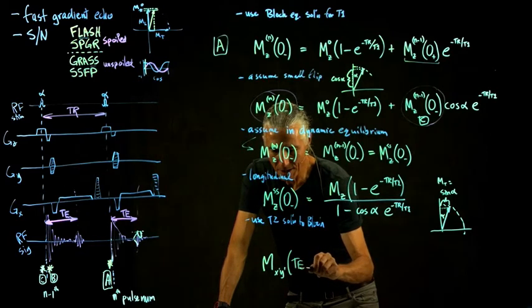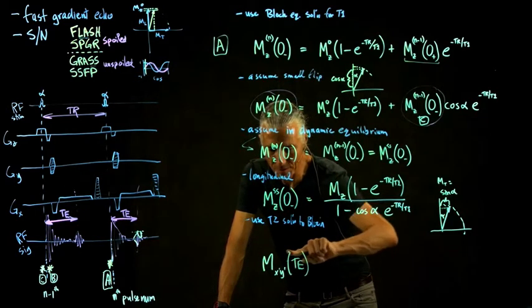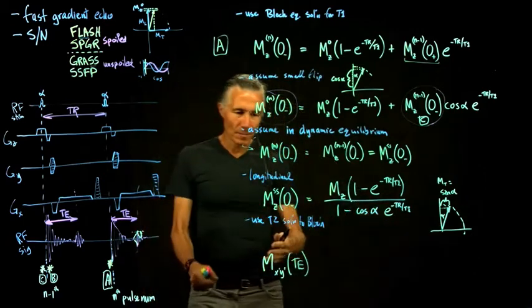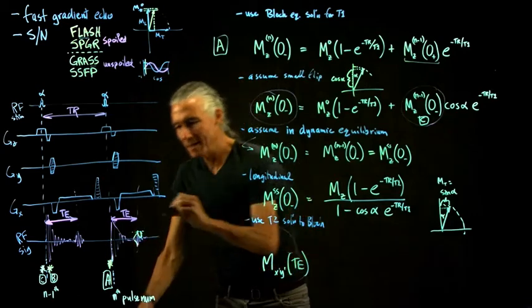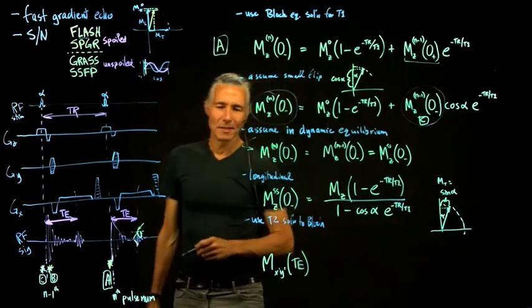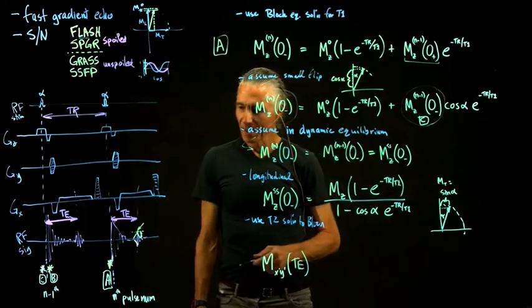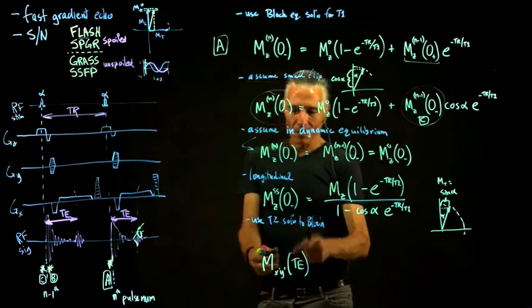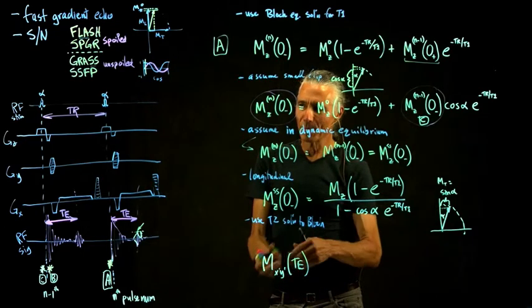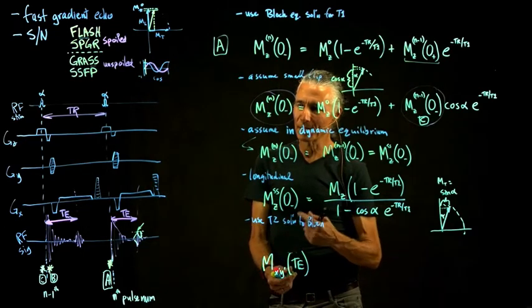So we could calculate it for some other time, but for the current purposes, we just care about what is here at the center of K space? So how do we get to xy, and why is it xy? It's x prime, y prime, because we're in the rotating coordinate system, so we don't have to worry about the precession business.